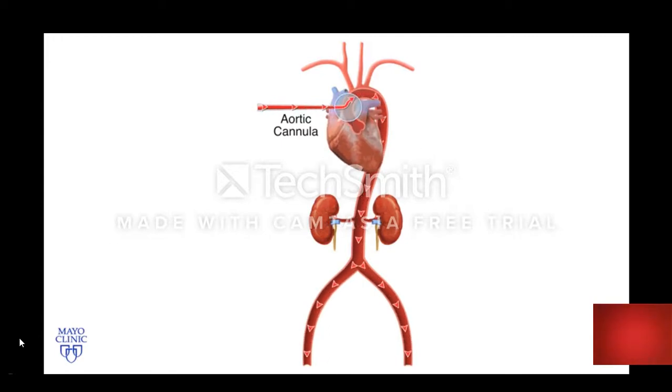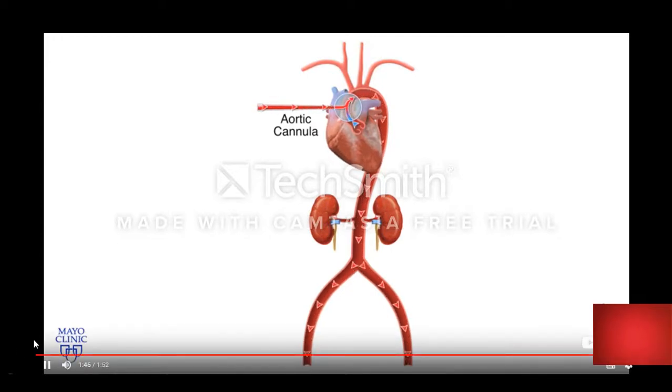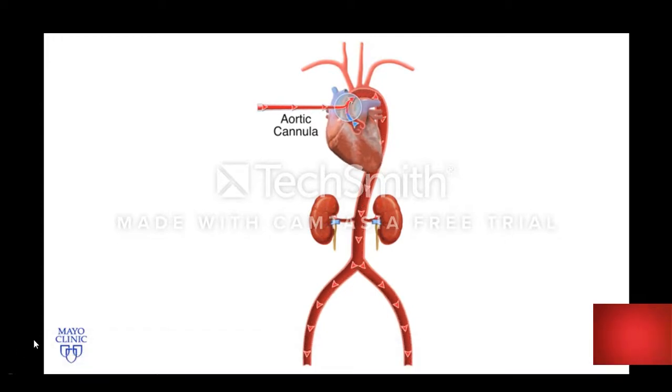Care should be taken to adequately oxygenate blood traversing the aortic valve if the lungs are capable.